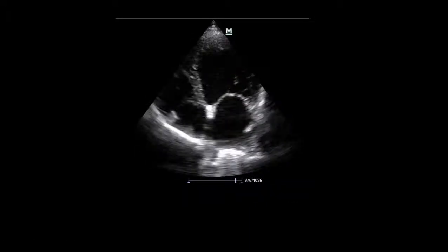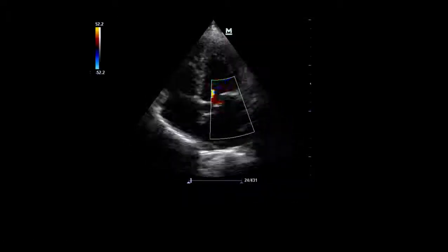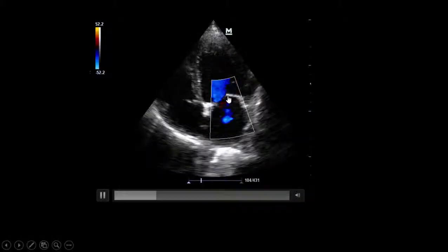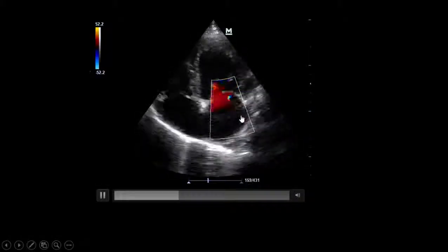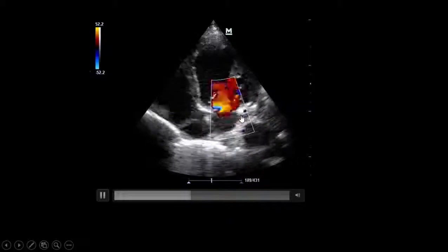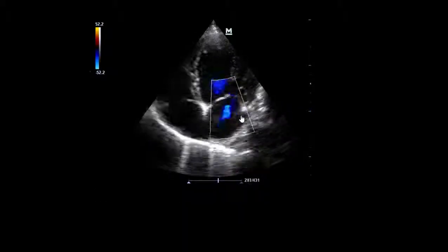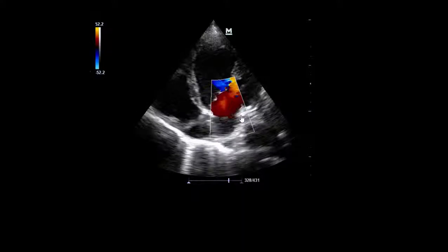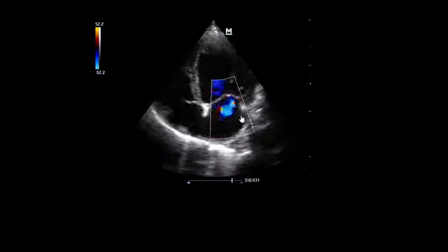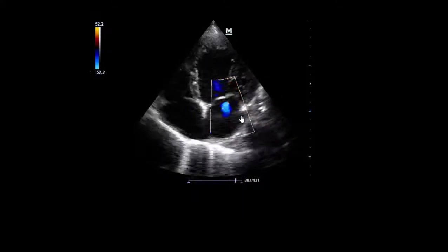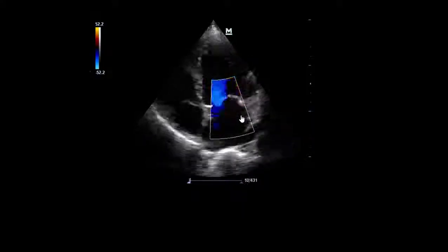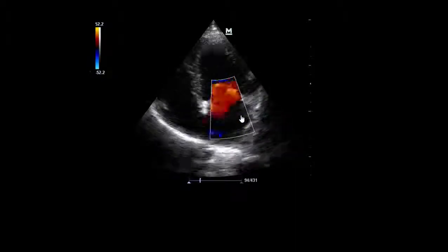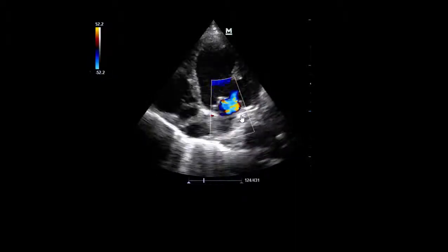Color Doppler shows moderate mitral regurgitation, completing the picture of ischemic dilated cardiomyopathy post-CABG. The patient has now developed pneumonia, and following one liter of normal saline and 500cc of 5% human albumin, the IVC shows 20% distensibility suggesting possible fluid benefit.